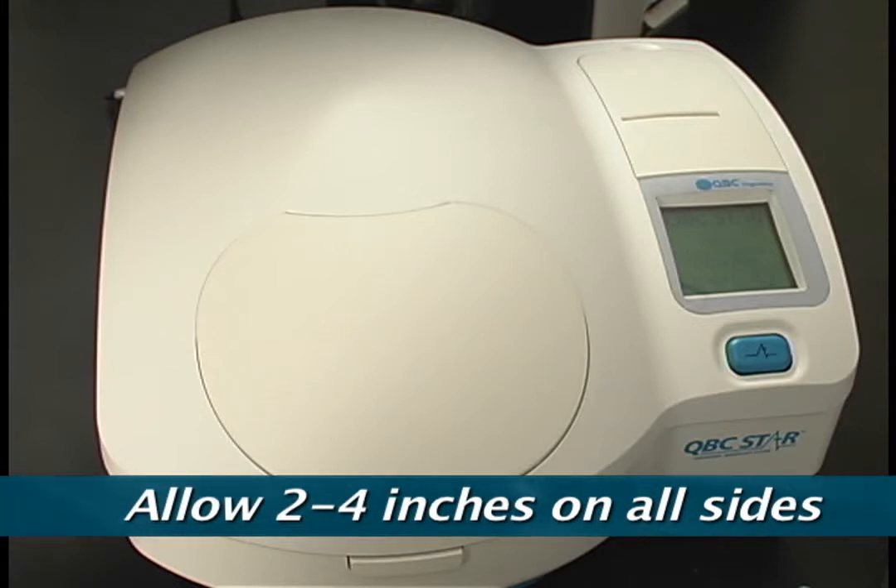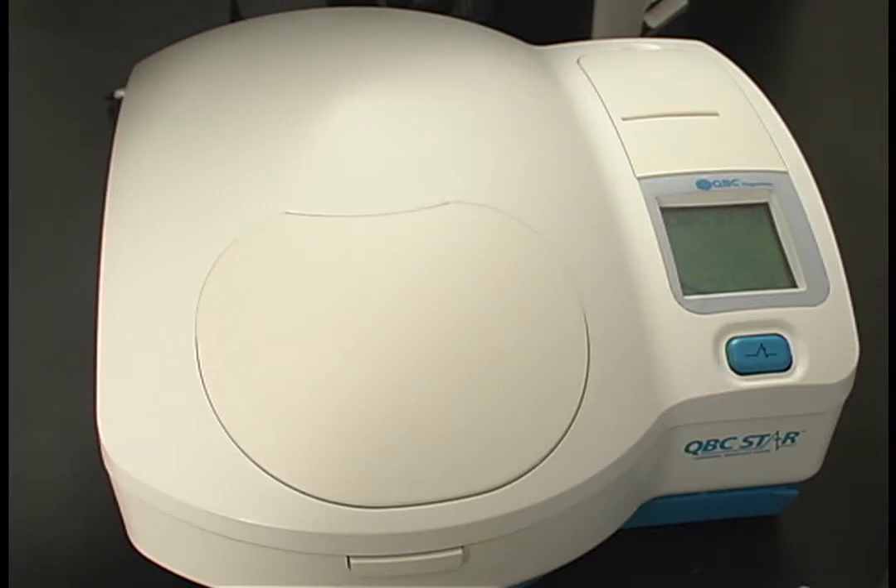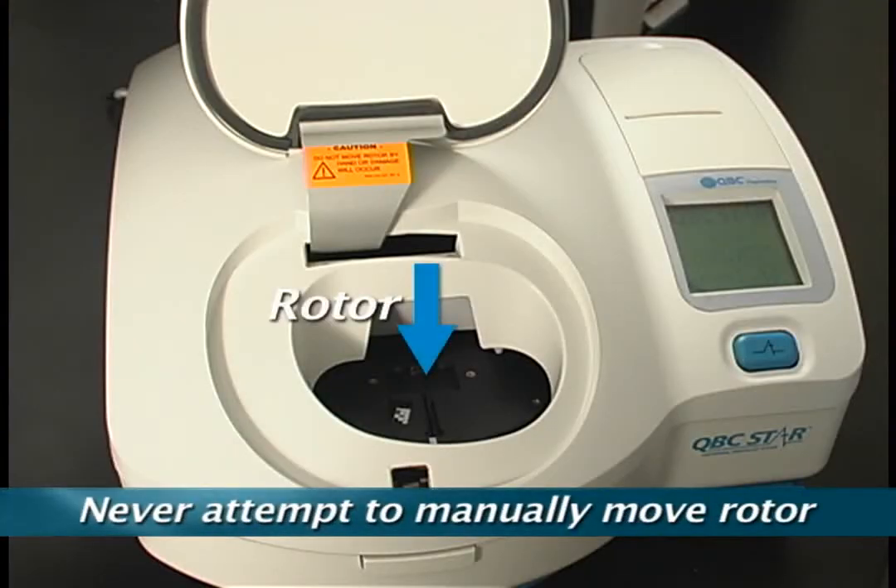Also, make sure that there are no obstructions under the unit such as towels or rubber mats. It's important to note that the rotor moves freely at this time. During your day-to-day operations, the rotor will be fixed in place. Never attempt to manually move the rotor as this could cause damage to the instrument.